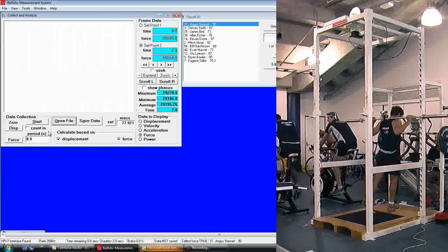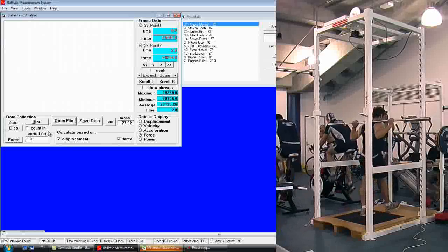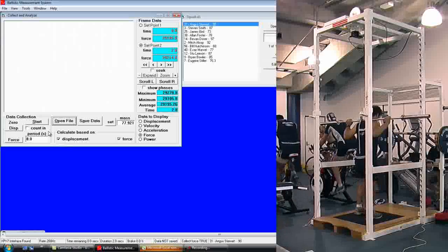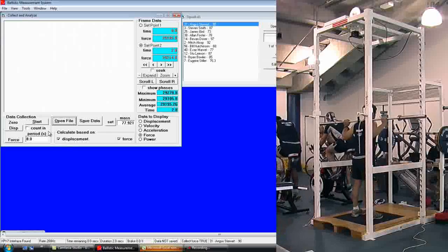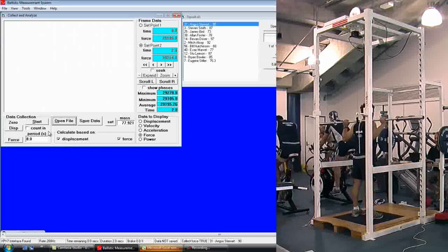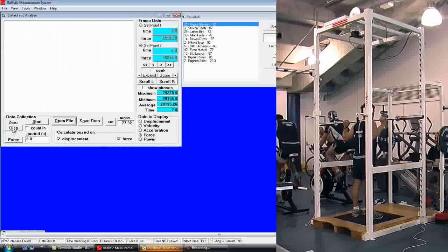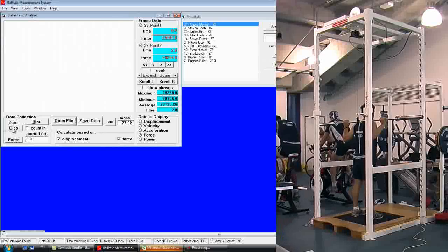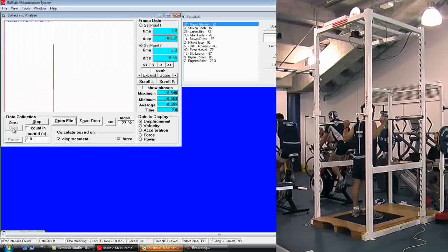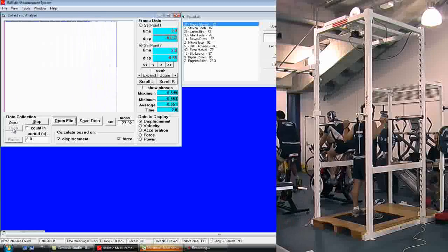Then get the athlete to take up the bar and step back into the center of the plate. Stand perfectly upright and still and click on Zero Displacement.